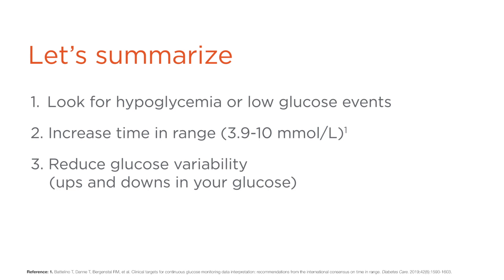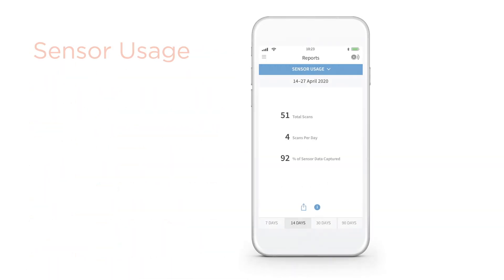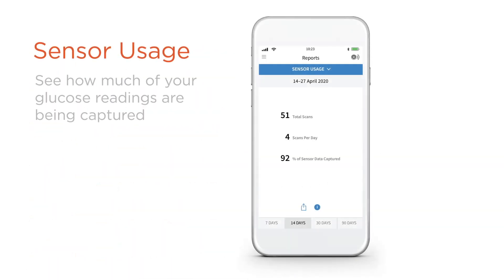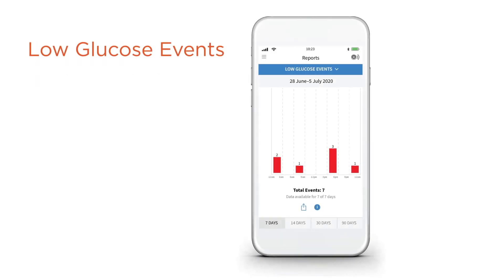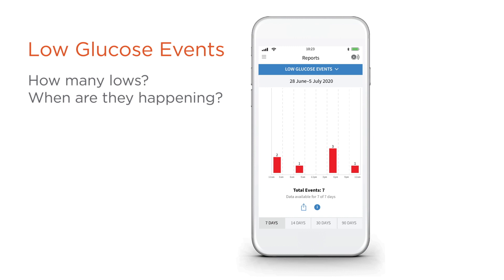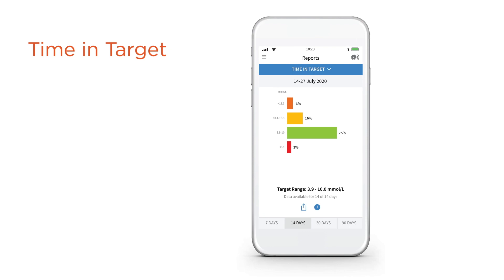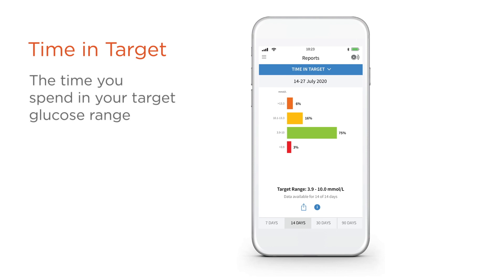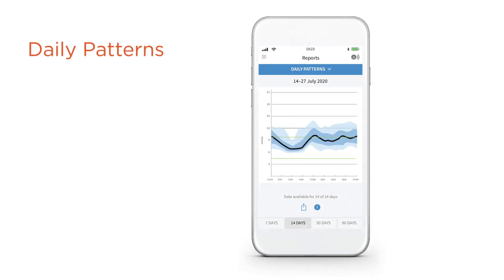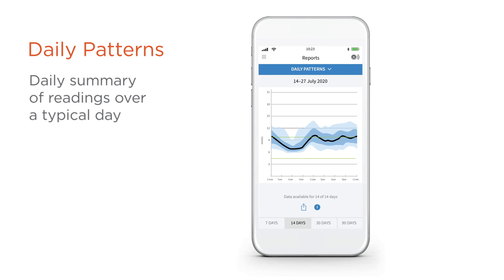Freestyle Libre can quickly summarize your readings so you can find the answers you're looking for. The sensor usage report shows you how much of your glucose readings are being captured. The low glucose events report gives you information on how many lows you are having and when they are happening. The time and target report shows the percentage of time that you spend in, above, and below your target glucose range. Finally, the daily patterns report summarizes your readings over a typical day so you can see patterns.